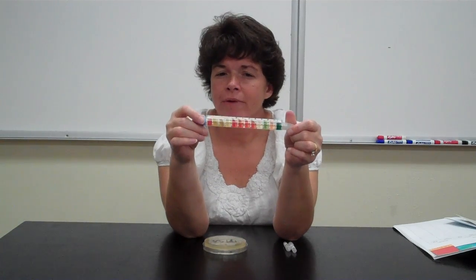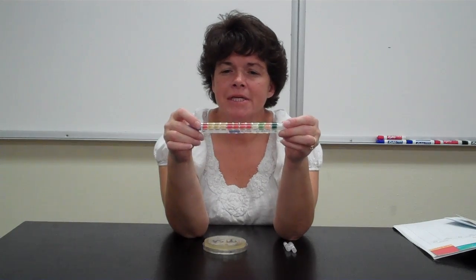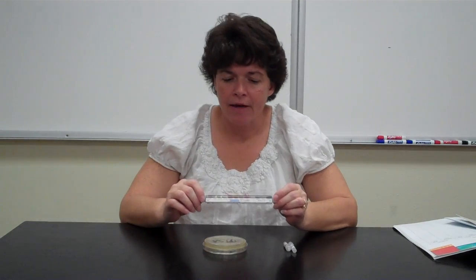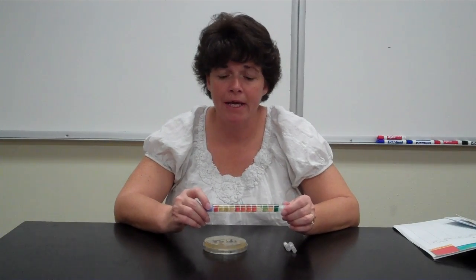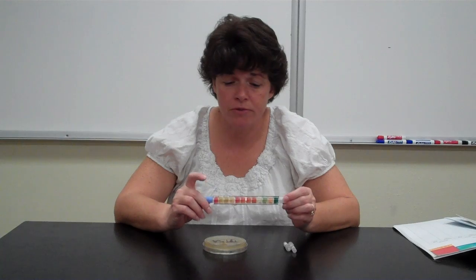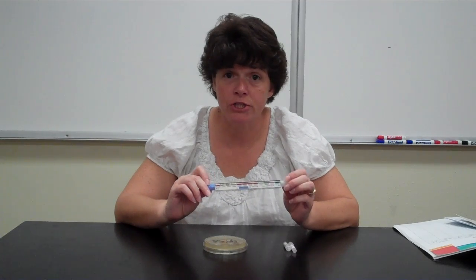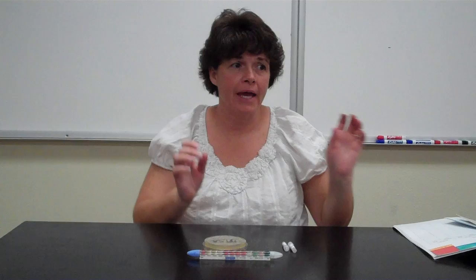The enterics are all gram-negative. When we did chapter 11 with the dichotomous key, we talked about how the enterics all fit into that family that has flagella, and they're gram-negative. They're mostly rods, and one of the other characteristics is they do ferment glucose. So at the very least, you'll see a color change in this first compartment, unless you're given a bacteria that is not an enteric.